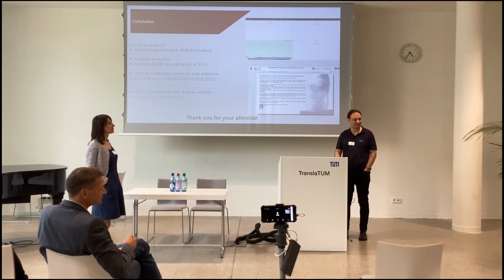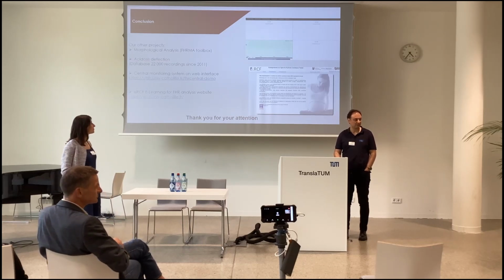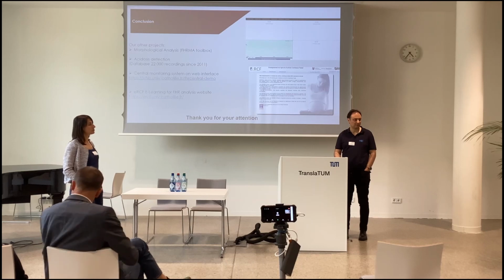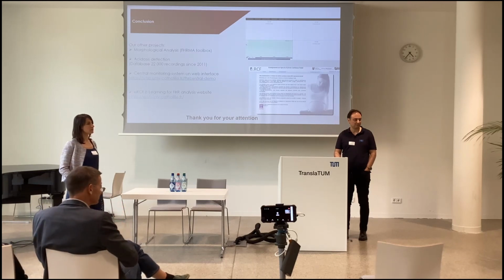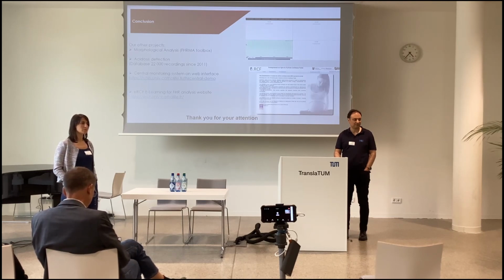I have a question about your results. Maternal interference happens regularly, of course, but it's still by far in the minority of the tracing. So if you report accuracy, it's hard to see what you're doing and how you're improving. I'm wondering if you've looked at how often, for clear dropout, let's say having a clinician say this was in fact a maternal interference, how often do you do a good job for those specific cases?